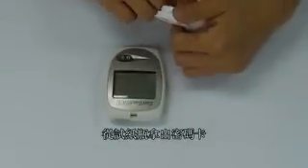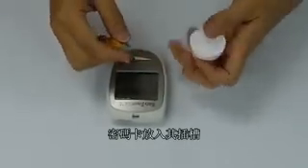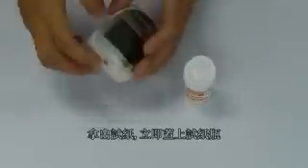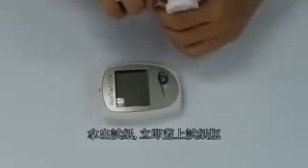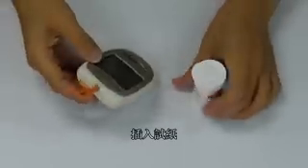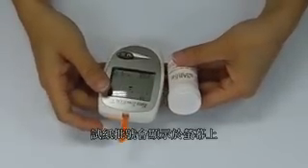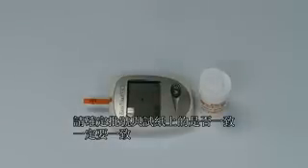Take out the code key from the test strip vial and insert it into the code key slot. Remove a test strip from the vial and close it immediately. Insert the test strip into the test strip slot. Note the code number displayed on the LCD, and be sure that it matches the code number on the test strip vial.